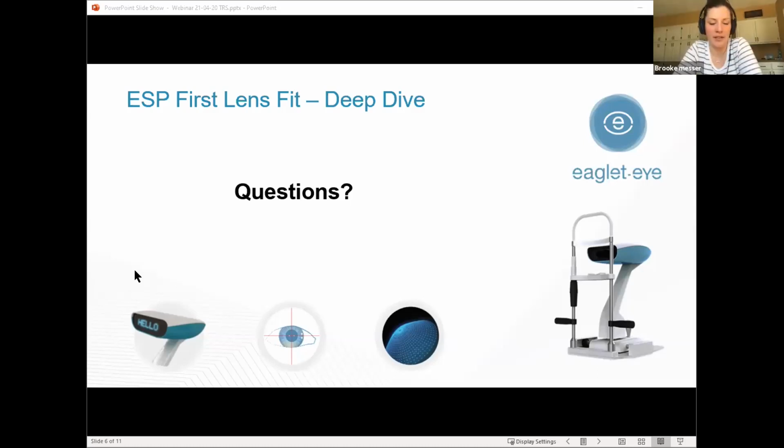Tom, I can add a little bit of comments on the processing time. Sure, Brooke, go for it. So what I've done is I've taught my tech the information that I like to get off of the scan. We'll take the patient in, do the topography, and then I'll take them back and do something that we would need anyway, like baseline refraction, because we're usually managing the keratoconus.